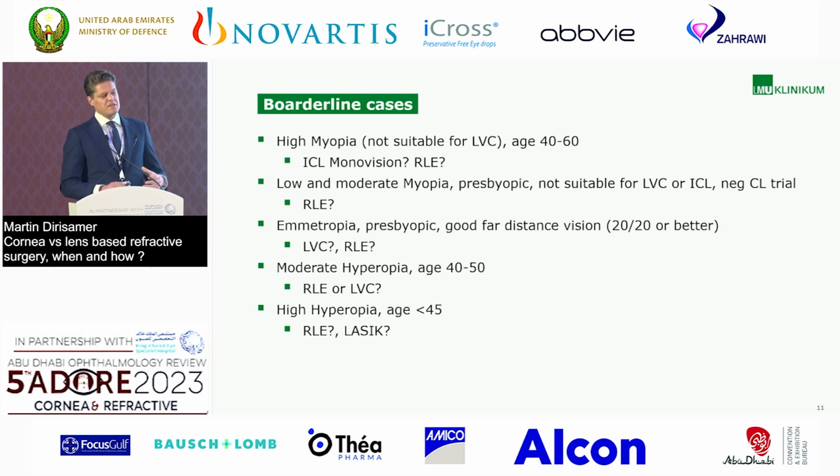What about moderate hyperopia, age between 40 and 50? Do you go for a refractive lens exchange or laser vision correction? And probably one of the most tricky situations, the high hyperopia. So the age is below 45 and high hyperopia.